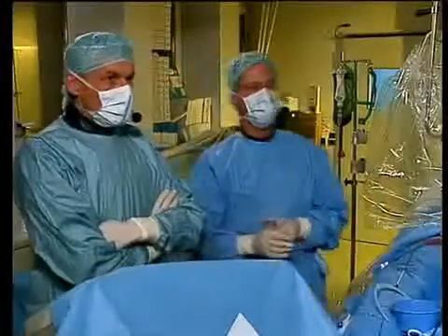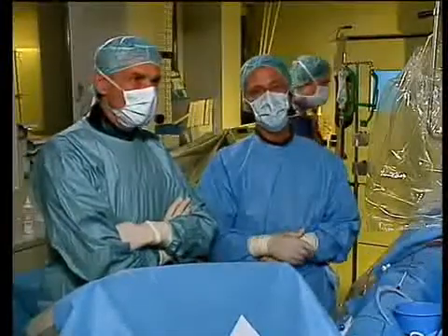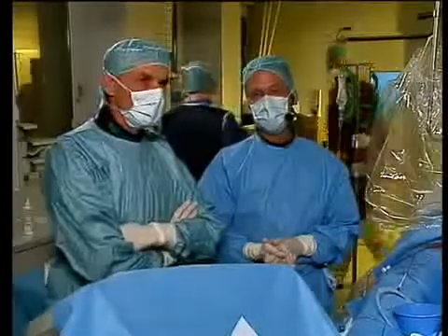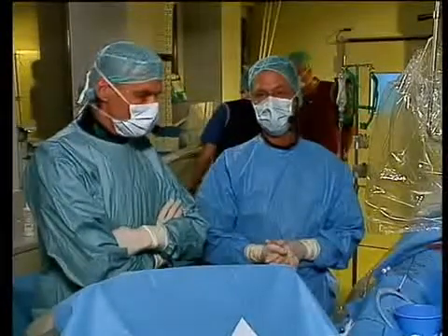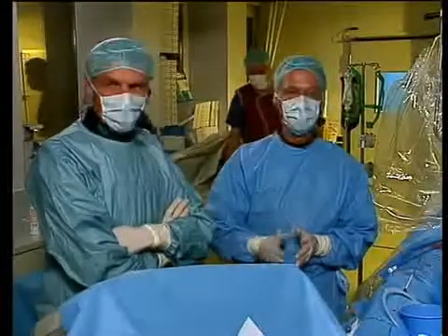So, Jacques, we have case number 16 here, and with me is Professor Figola from Jena, who is working on a new PFO closure device. But before he explains what he's going to do, I think we should present briefly the case.